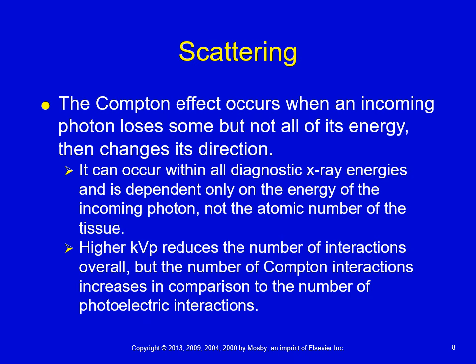The second thing that can happen when the x-rays enter the patient's body is something called scattering. The main type of scatter that you as a tech are concerned with is going to be something called Compton scatter. There are other types of scatter which will probably be addressed in another lecture, but we're concerned with the Compton scatter. So with Compton scatter, we have x-ray photons coming into the patient. They're hitting outer shell electrons, middle to outer shell electrons. Remember that with the photoelectric effect, we're talking about inner shell electrons. With this one, it's mostly middle to outer shell electrons.